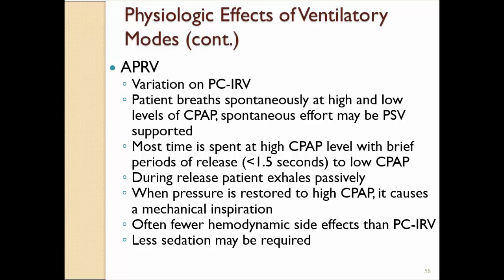Often fewer hemodynamic side effects as compared to PCIRV, and less sedation is required, because most of the time you don't want these patients sedated at all. You want them breathing spontaneously.